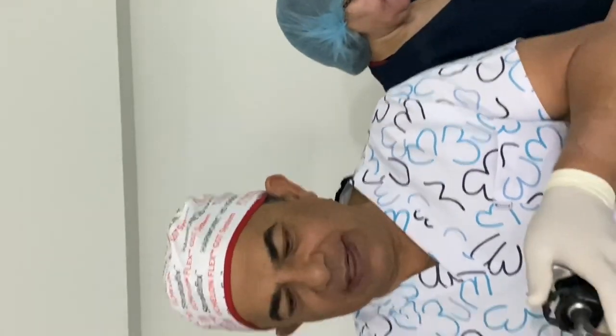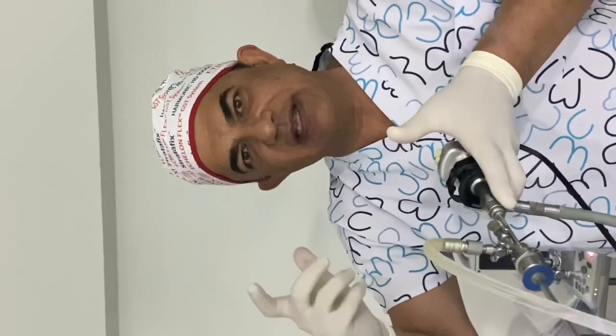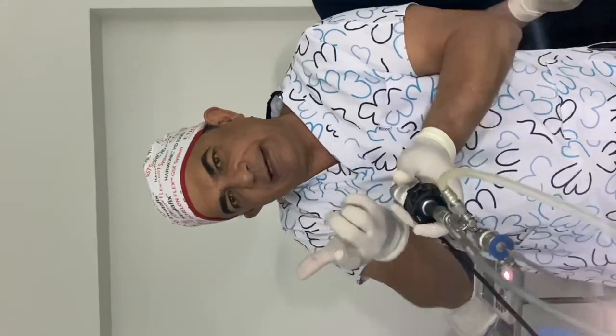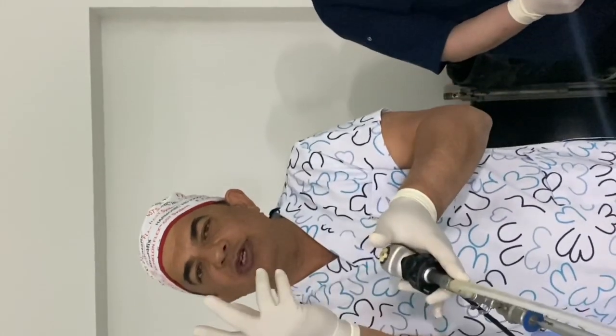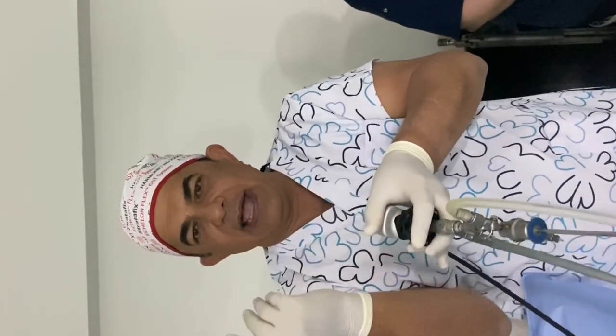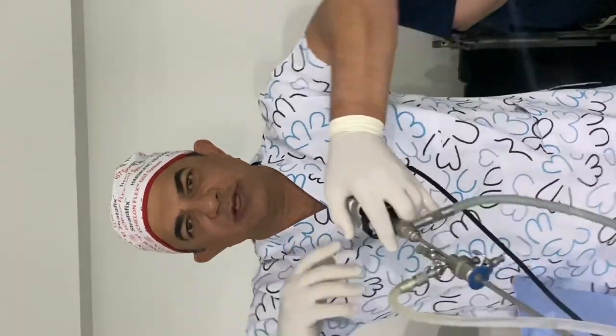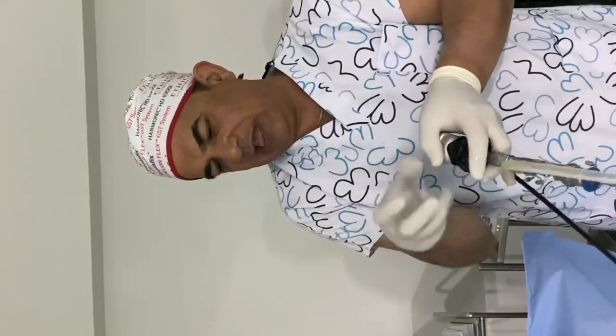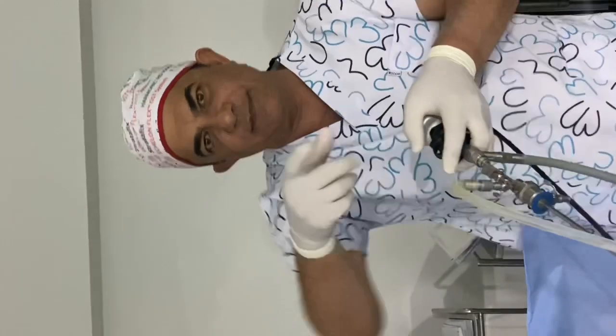When I say rotating the whole system, people think we have to rotate the light cable — that's okay for a diagnostic procedure. But if you have one hand holding the scissor and one hand holding the camera, how can you reach the light cable? So rotate the whole system like this. When you rotate the whole system, the scissor will rotate — correct by rotating the scissor to the opposite side. Use two joints: the wrist joint and the elbow and shoulder joint. Don't fix your elbow to your side; that gives restricted movement.